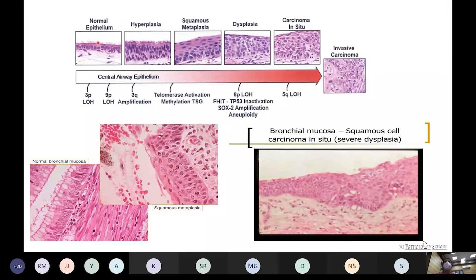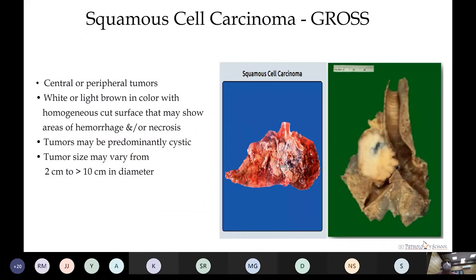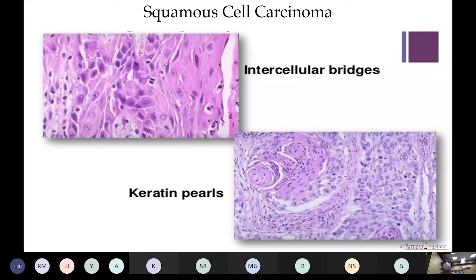The normal pseudostratified tall columnar lining epithelium transforms into squamous metaplasia due to smoking-related and other carcinogenic factors, progressing to severe dysplasia affecting more than two-thirds of the lining epithelium. On gross examination there are cystic areas, hemorrhage, or necrosis on cut surface, predominantly cystic in nature. Microscopically, the characteristic features are intercellular bridge formation, keratin pearl formation, and individual cell keratinization.